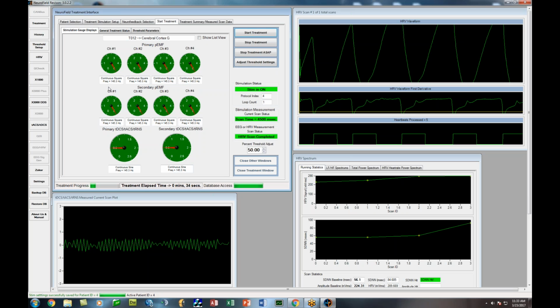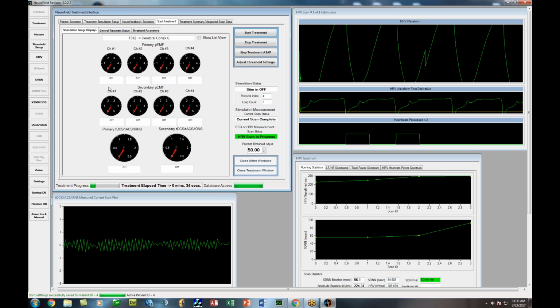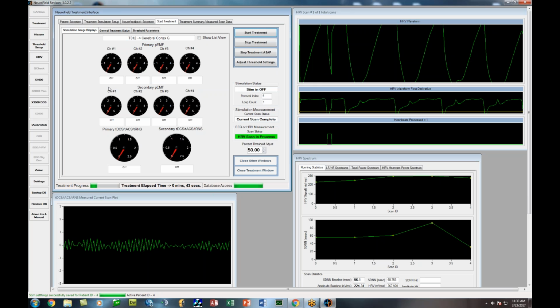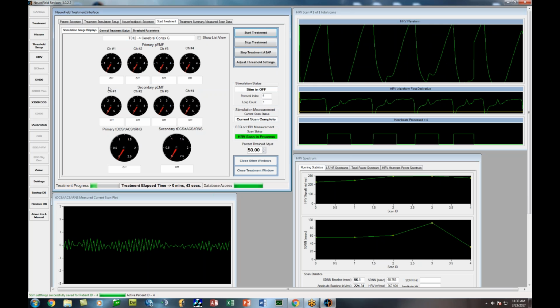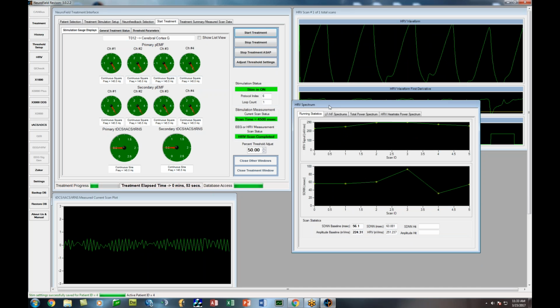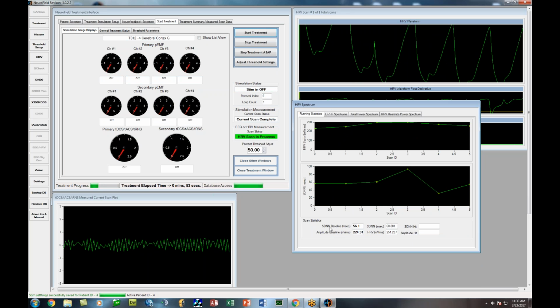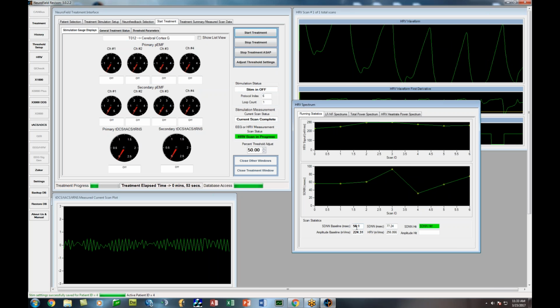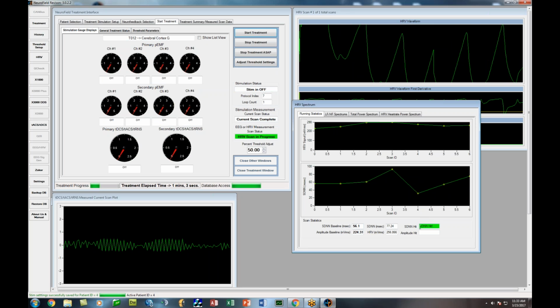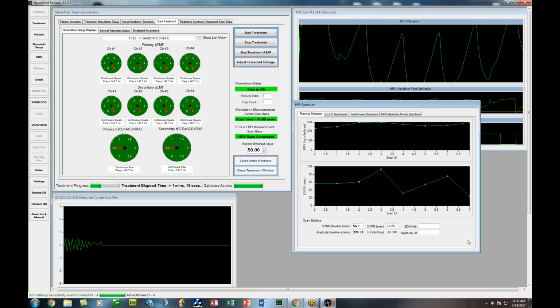This procedure is a muscle testing procedure. We're muscle testing the heart. We're seeing where variability occurs, and when we see the changes in variability, we say that those are yes responses from the body. And we take those yes responses and we put them in a table. And that table is going to be what we use to actually treat the person. So here we see the SDNN baseline was 56.1. In order to get a hit, it has to come in above 56.1 or 66.1. When you get one, it lights up here. You see SDNN hit, and when you don't get one, it won't light up.